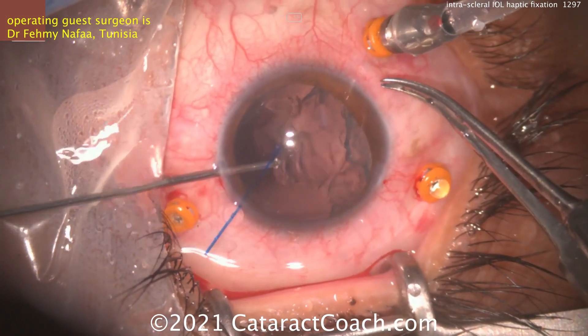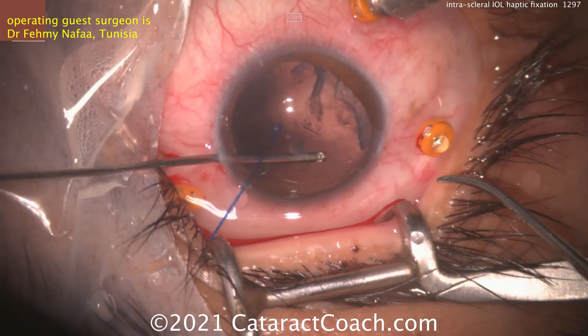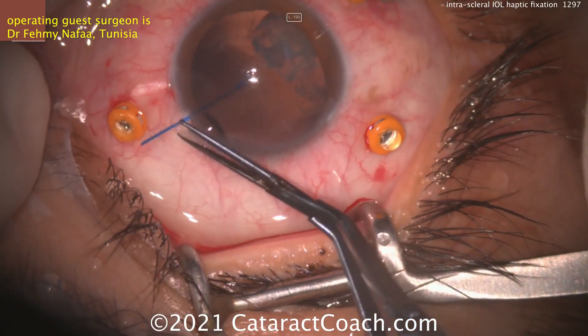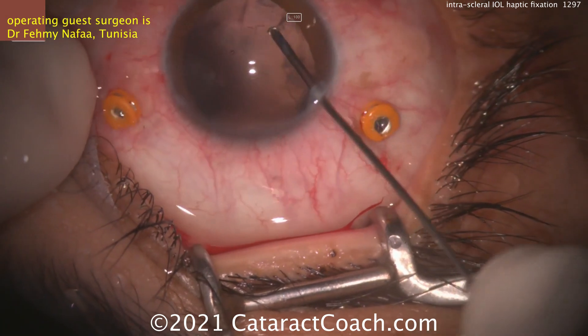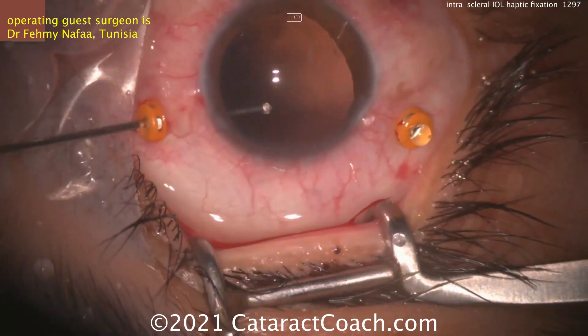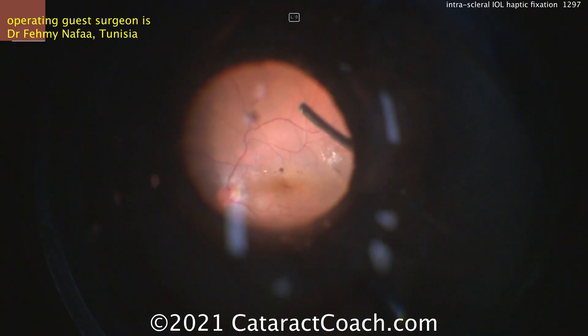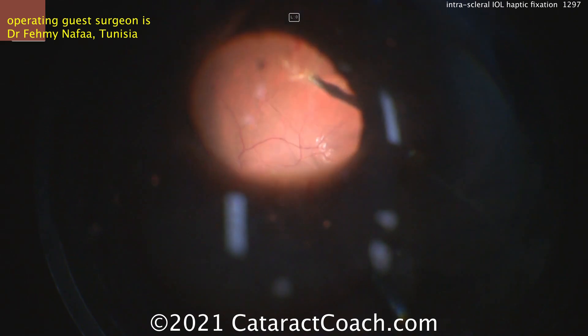For me, I don't perform pars plana vitrectomy, and so I would do this case in combination with a retina specialist and have the retina specialist do the full removal of the lens nucleus. You can see the nucleus is mostly removed, a little bit left — try to clean that up. You're going to need to do a full pars plana vitrectomy in this case. There's the full pars plana vitrectomy — very nicely done. Good to have that expertise.